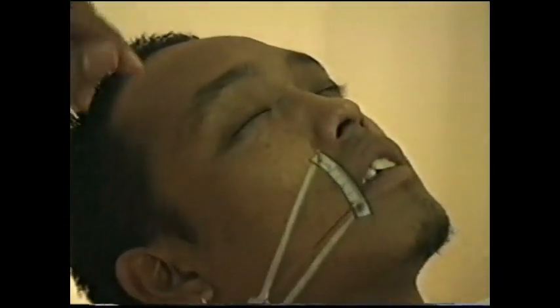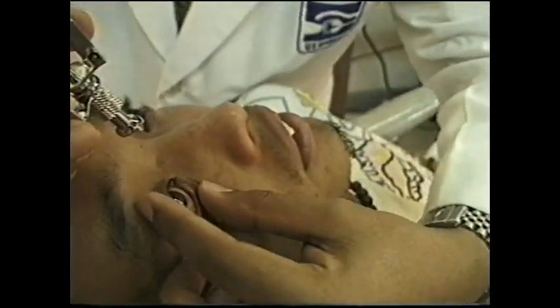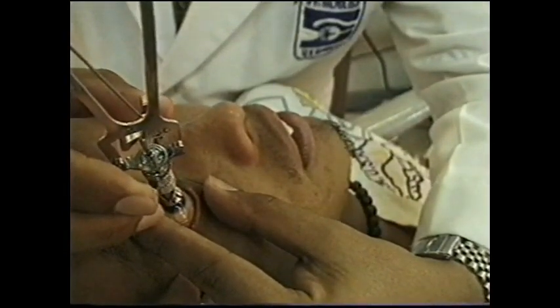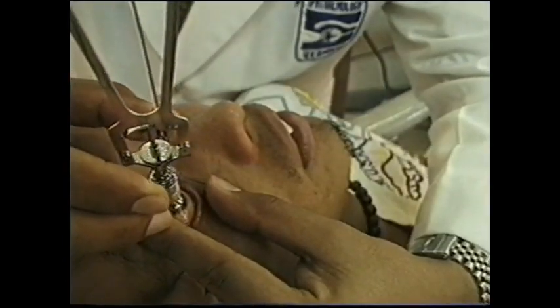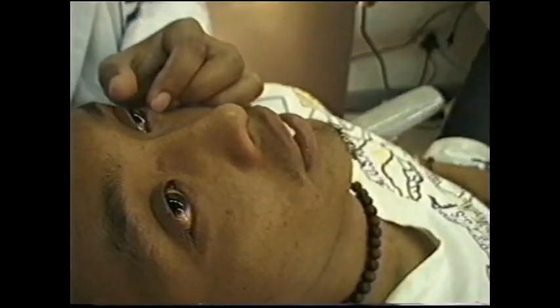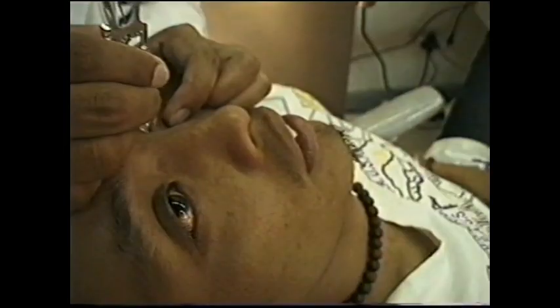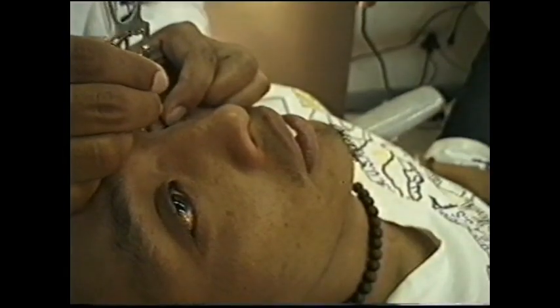Ask your patient to open his eyes. Position your fingers on the Schiotz tonometer in such a way that your thumb and forefinger are on the arms of the tonometer. Ask your patient to look up at the ceiling. Open the eyelids and assist your patient, making sure that no extraneous pressure is placed on the globe. Apply the foot plate on the cornea and take note of the reading on the scale in front of you. Ask your patient to blink once and perform on the opposite eye, again making sure that while assisting the patient in opening his eyes, you don't exert extra pressure on the globe.